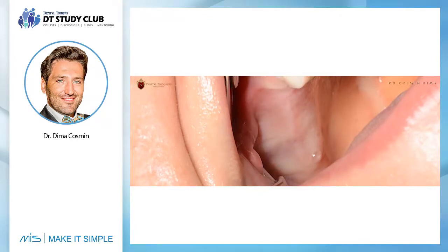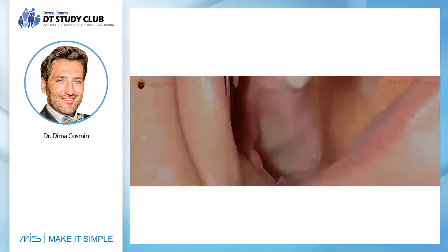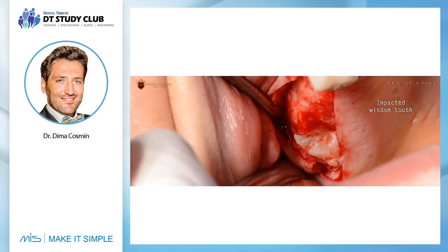One of the few times when I see a patient with such a big width of the bone. Usually they have nothing, but in this case the patient was very generous, but unfortunately we need to augment the area vertically this time.